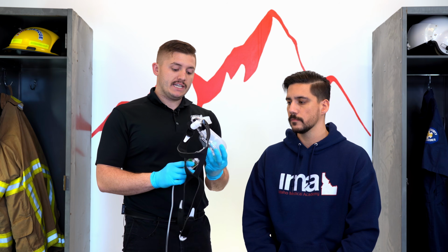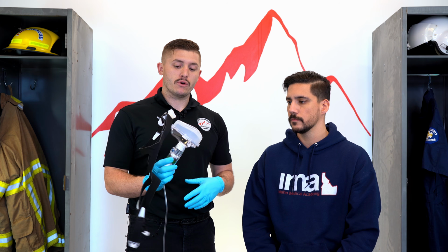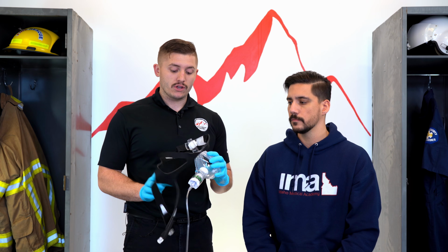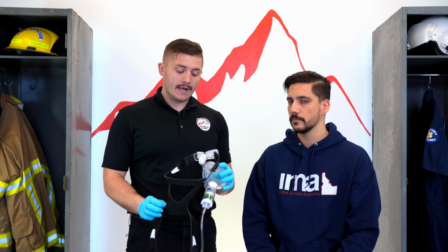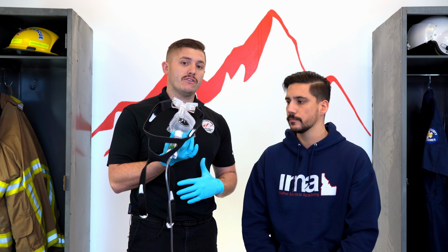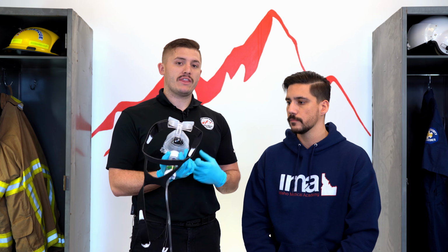Your patient, if they need this, is in a pretty bad spot. They're really, really sick. They're going to be anxious. They're going to be tripoding. They're going to be talking 2 to 3 word sentences. So the quicker we can get this on, the better, and the more we can talk our patient through this. It is very uncomfortable to have this on your face. Every time you take a breath in, it's going to push air into your mouth, which makes patients very, very nervous.